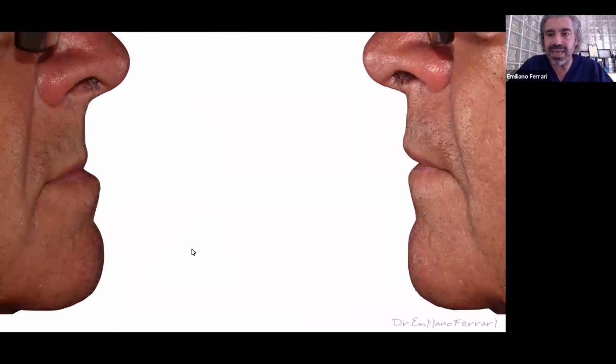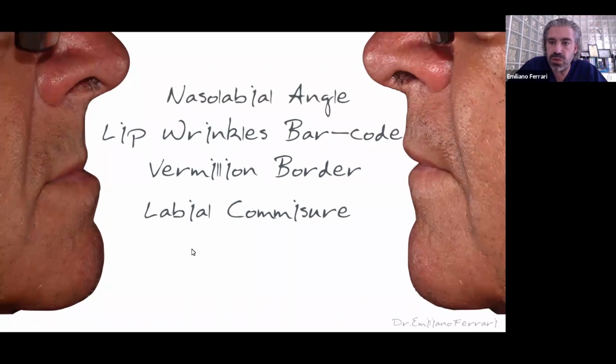So this is a case in which we chose removable treatment because of the need for lip support for our patient. Okay. So we want to give a restoration with the performance of a fixed prosthesis, but we prefer a removable denture because we need something that helps the patient in the support of the lips.